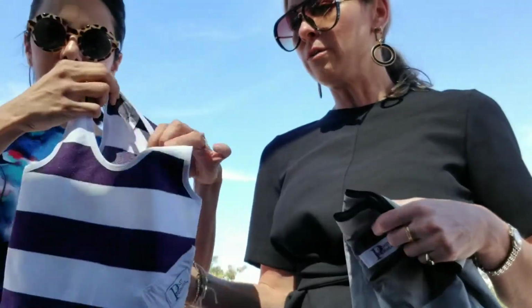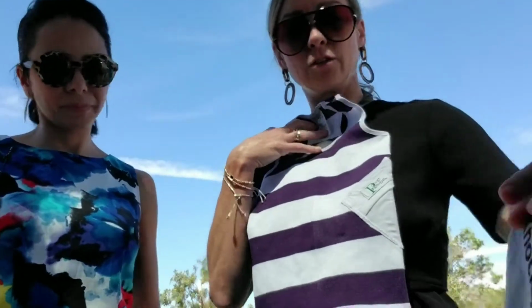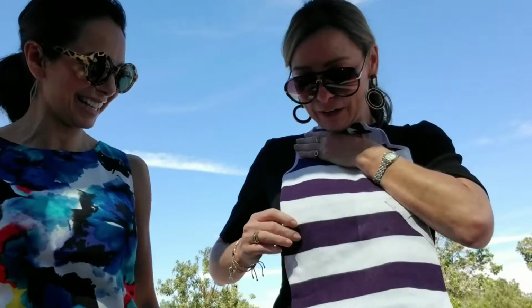And then you also have these nice stretchy tank tops. These would even be great for kids because they come in different sizes. You can put the pump in the pocket right here on the side, which fits in your rib area, where everyone has the smallest area anyway. It would hide it and tuck it away without it showing in the clothing. So there are a lot of nifty ways to conceal your pump.